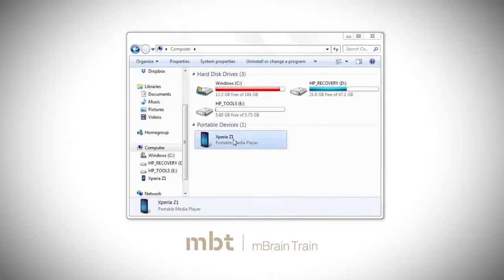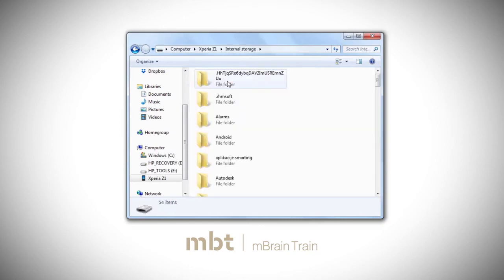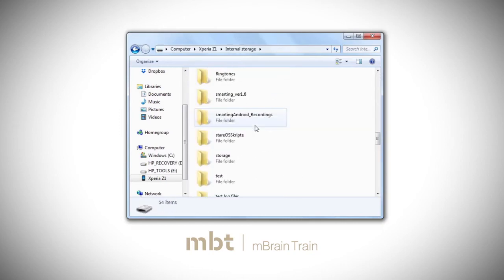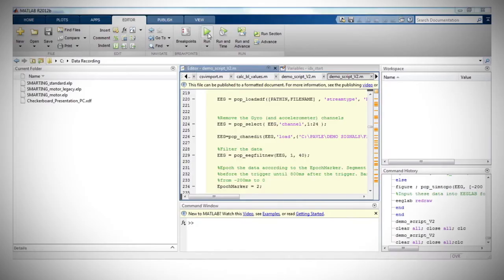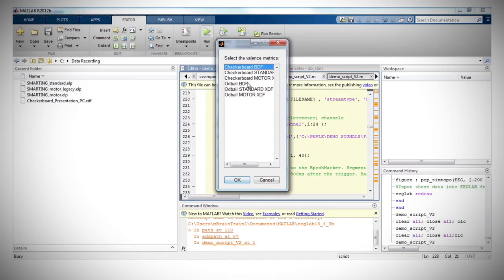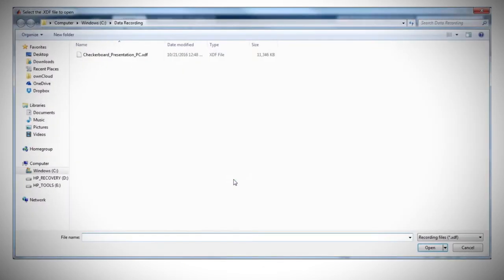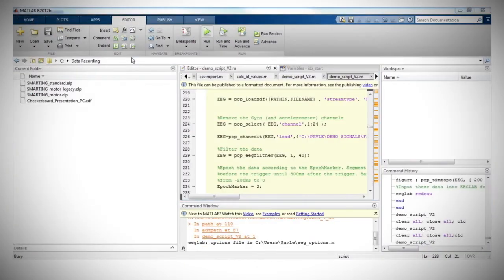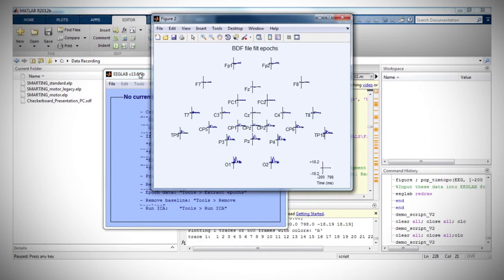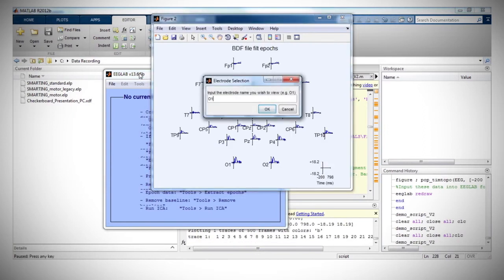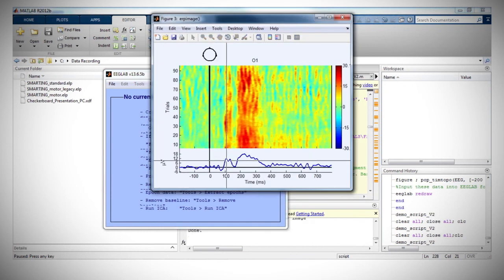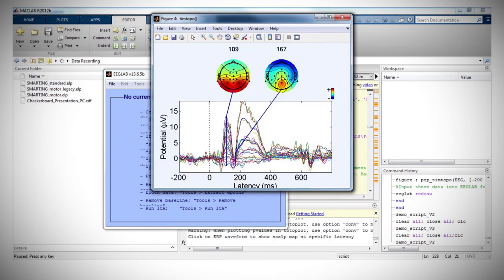The data from the smartphone recordings will be stored in the Smarting folder in the smartphone's internal memory. The data can be processed in EEG Lab in MATLAB or any other software that supports BDF or XDF file format. Here we show an example of processing the data in EEG Lab Toolbox, where you can see the results of the checkerboard task and the visual component P1 in the occipital channels.